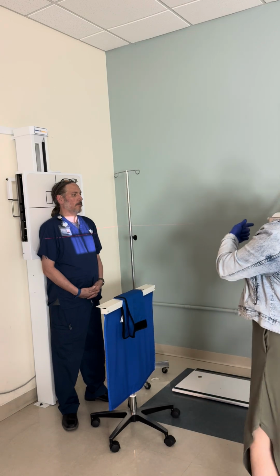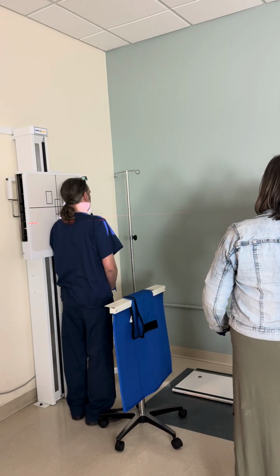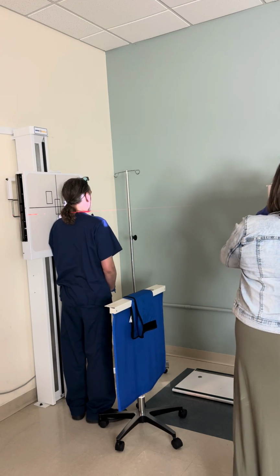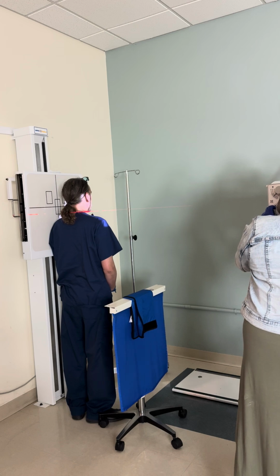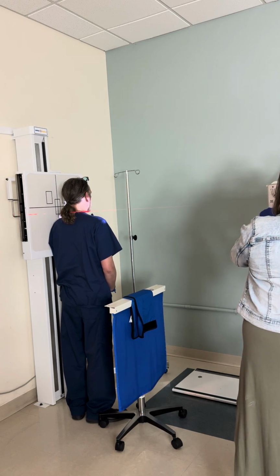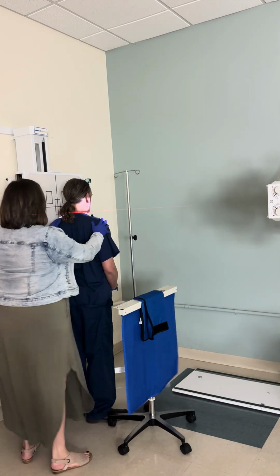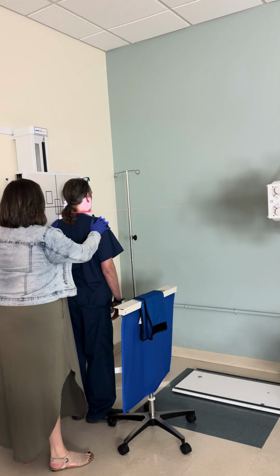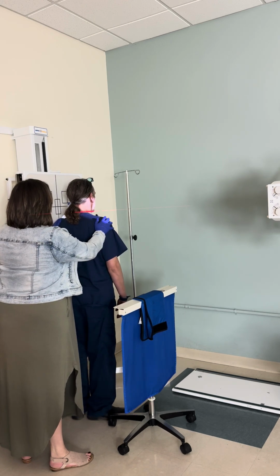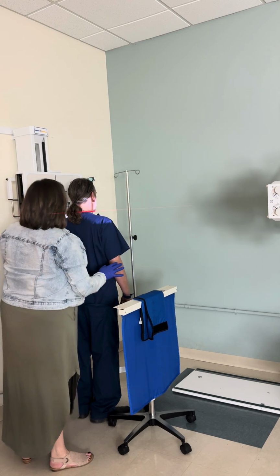And I'm gonna have my patient turn and face the left for me. And we are still sitting at the level of C4, so the top of the thyroid cartilage. I can collimate top to bottom a little bit, and go ahead and relax your shoulders down as best you can. Let your arms come down to your sides, and then step forward. Only a little baby step. There you go, because we want to be centered more on the spine, okay?